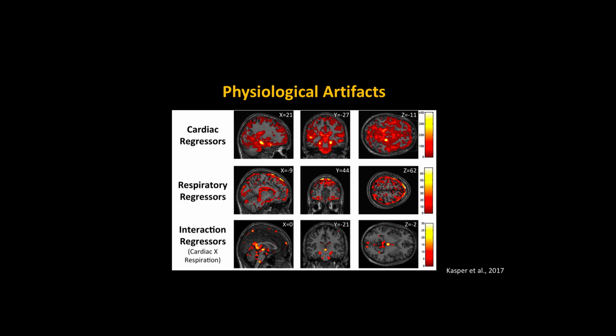Yeah, by and large, I would collect them unless you're on a really tight schedule and can't afford to take the time to hook them up, but it probably doesn't take that long. These are fast, they've got better tech. Pretty good at doing it without any time cost to you guys. By and large, I recommend recording them, even if you feel like you don't need to. But if you're in resting state, you should. Yeah, for sure.